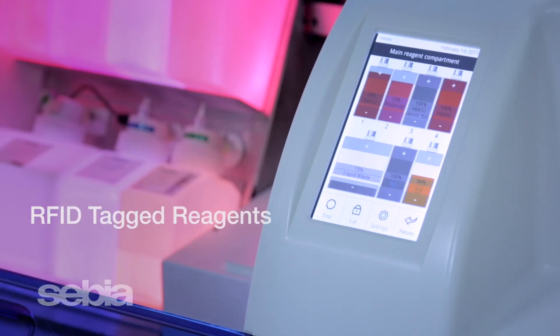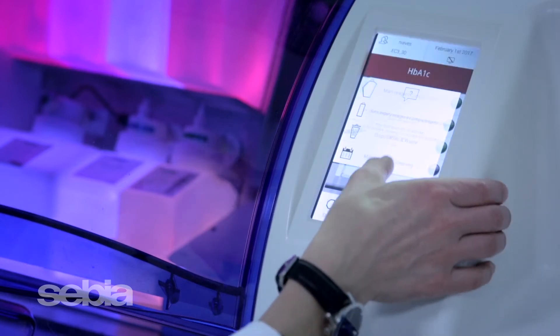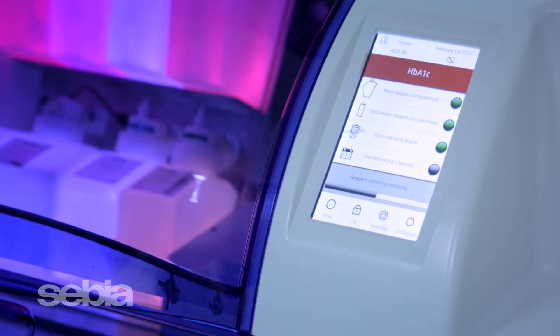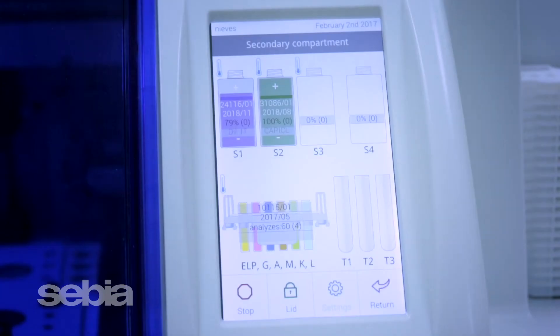Reagents are RFID tagged to automatically track all lot numbers, expiration dates, and test parameters, providing full traceability for your quality assurance program. A display of reagent utilization and information is visible on the touchscreen, providing an overall view of reagent status.